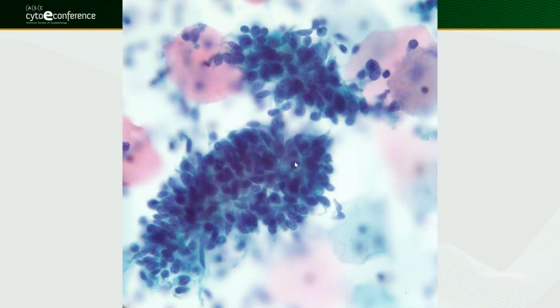And again, sometimes it looks like a bird's tail. It's used to describe AIS, how crowded and hyperchromatic and elongated the nuclei are, and the secondary acinar structures. And so this is AIS. Sorry, yeah. So this is more AIS, again showing similar things.